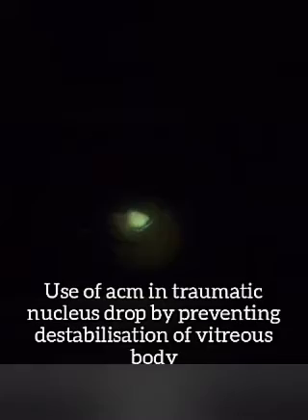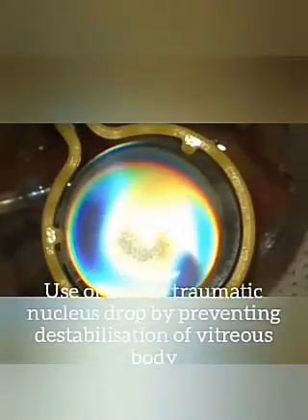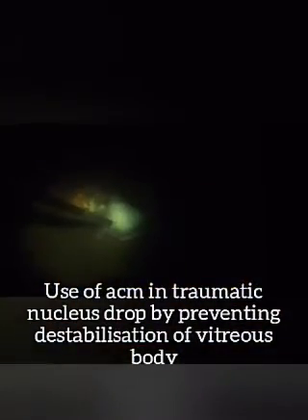Improving anterior chamber depth helps in managing traumatic nucleus drop by preventing destabilization of the vitreous body. It decreases the risk of PVD, peripheral retinal breaks, and retinal detachment.